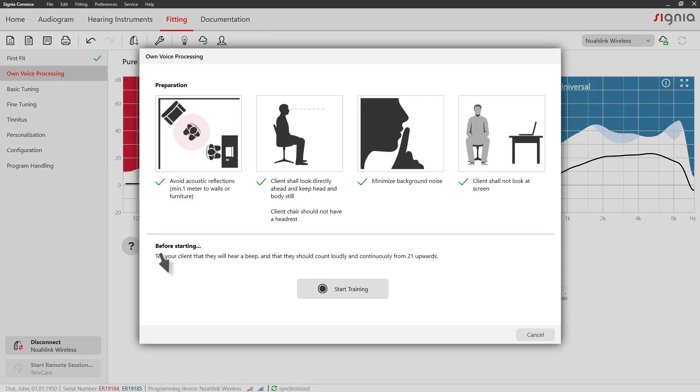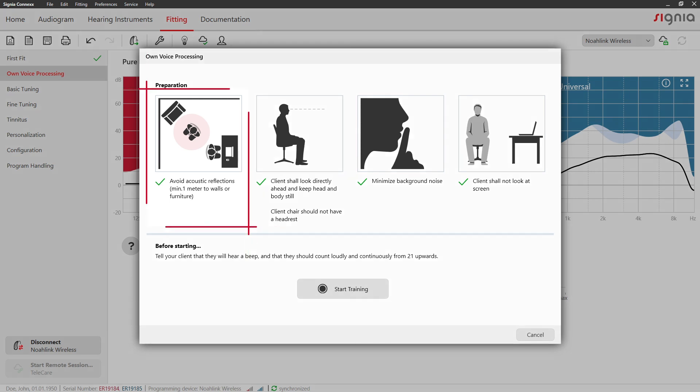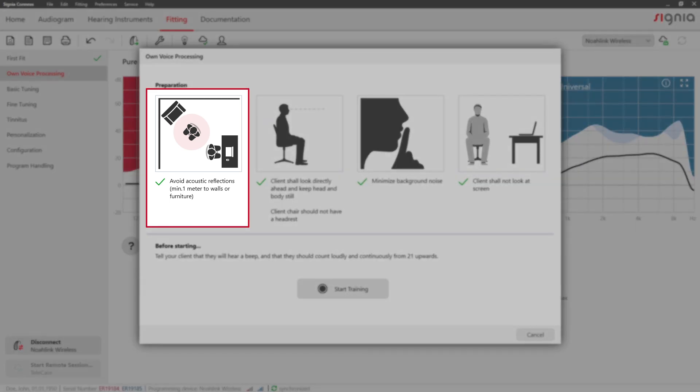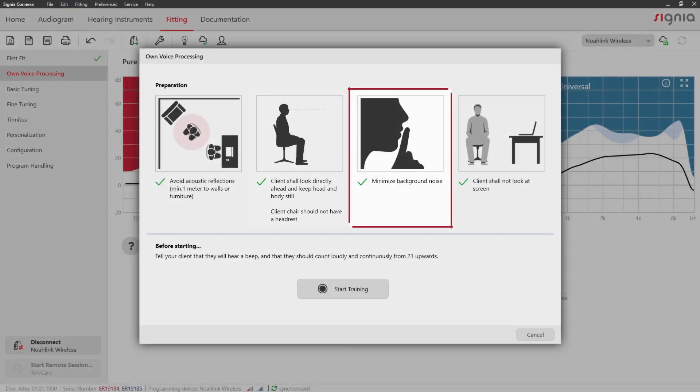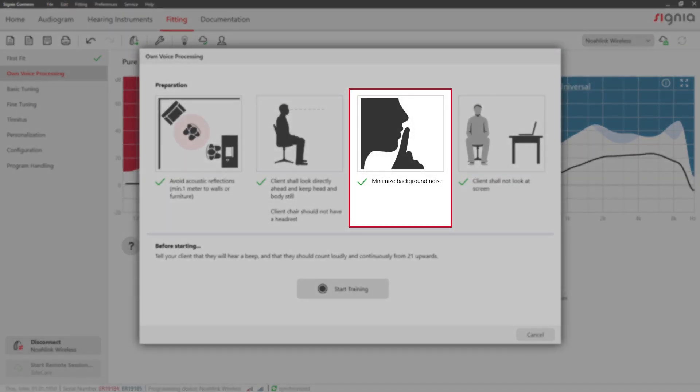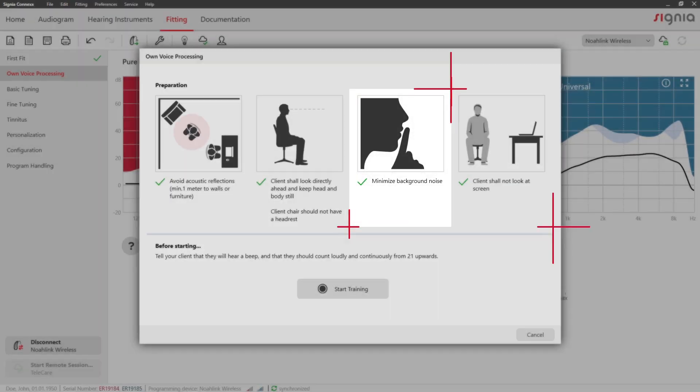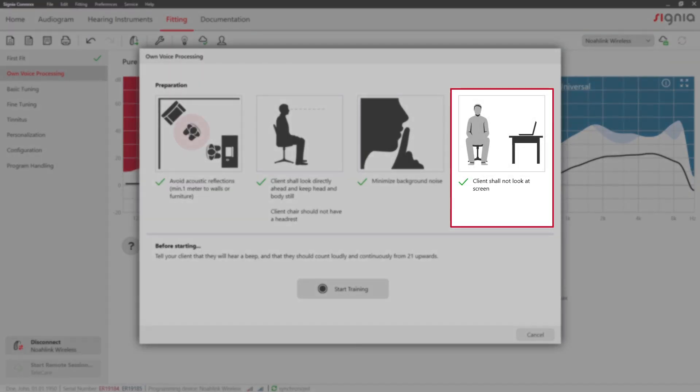Review these tips before starting the OVP training procedure. Make sure there is a distance of at least one meter between your client and any wall. Your client should look directly ahead and keep their head and body still. The chair should not have a headrest. Make sure to minimize background noise. Your client should not look at a computer screen.